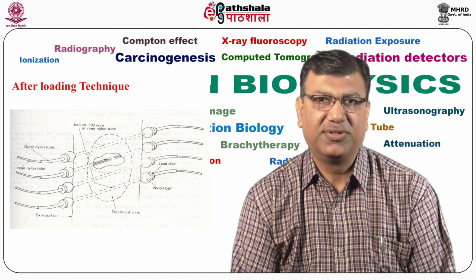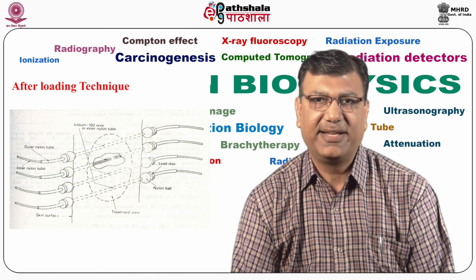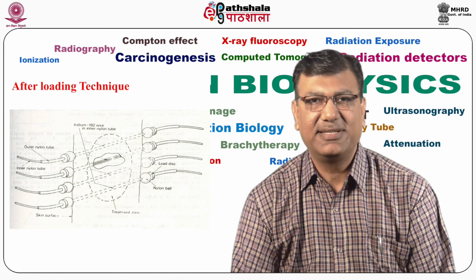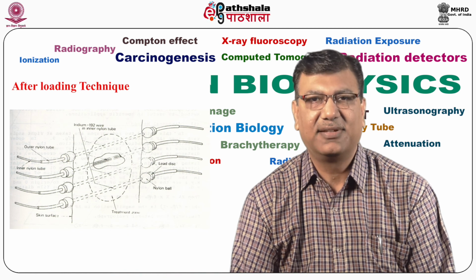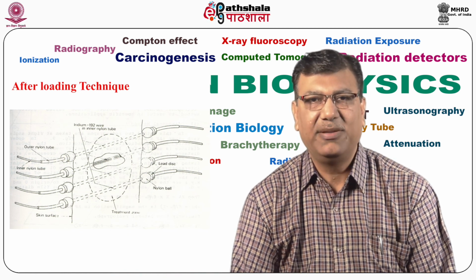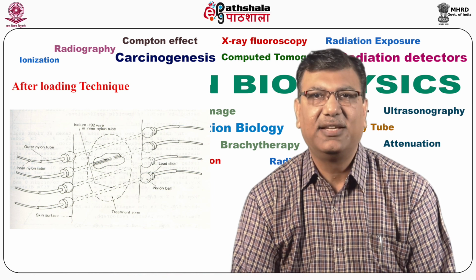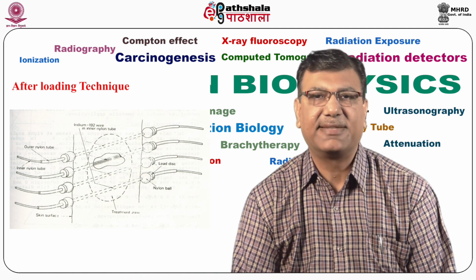This figure shows afterloading techniques. The applicators are inserted or implanted at the respective places, and then images are taken, either orthogonal images or most of the time CT images are taken, and sources are loaded according to that after planning the case.